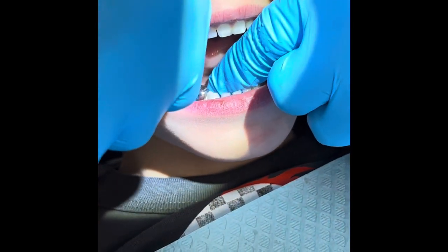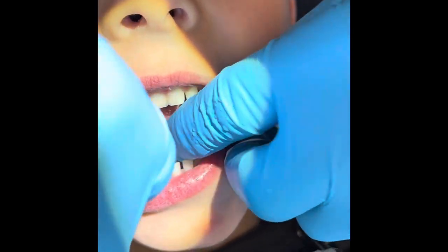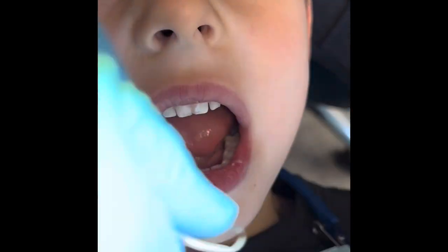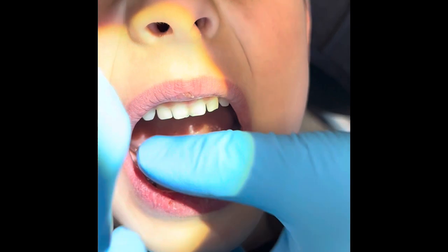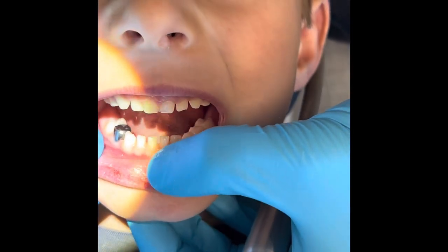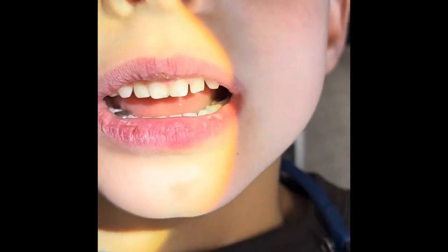Floss in there — open really big. Open, and then we'll pull it out the side. Open and floss, and pull it out the side. Just want to try to get as much cement out as you can. Good — and bite and squeeze together again. Squeeze, squeeze — nice job. Bite together. A little bit of blanching of the tissue is fine, that will go away. How you doing, James? Okay!